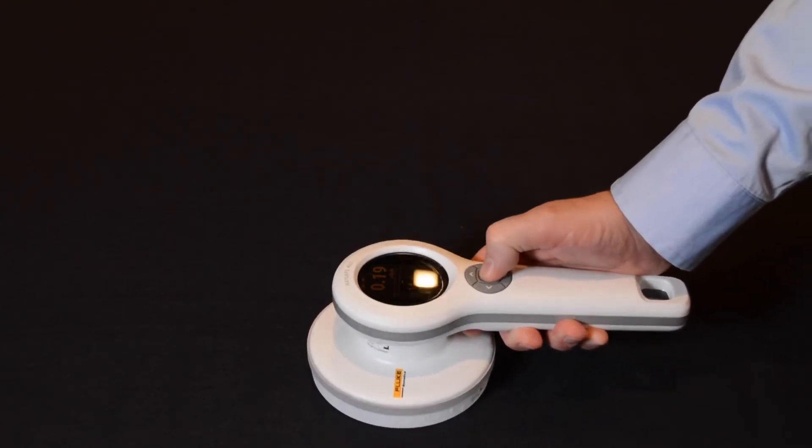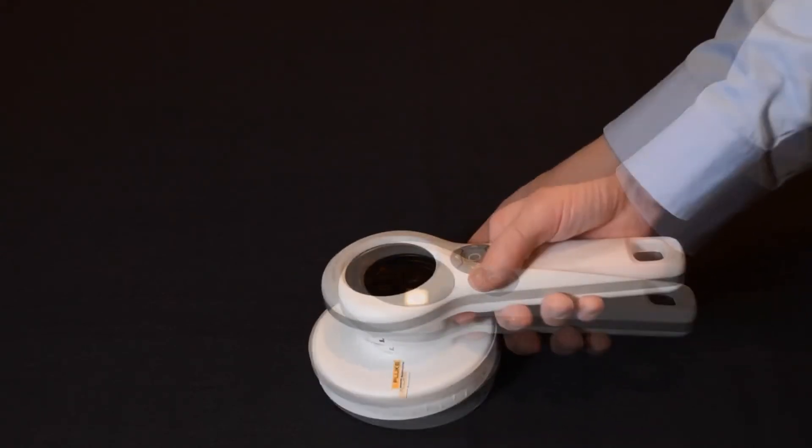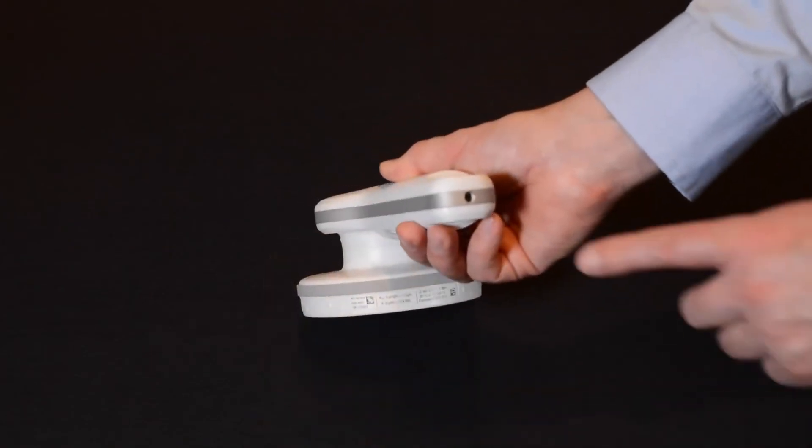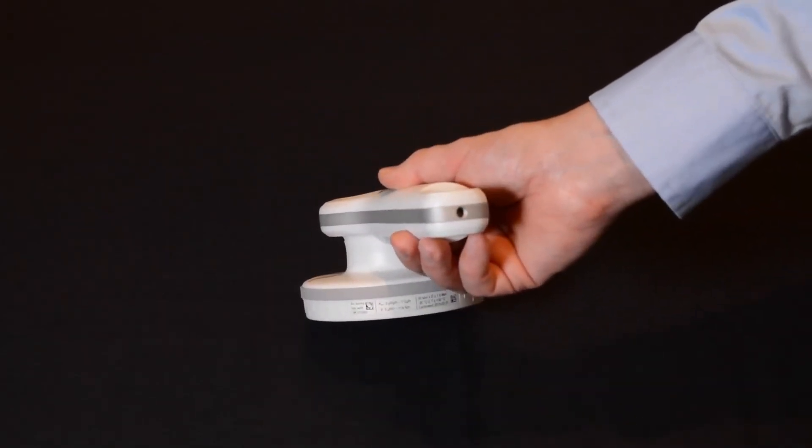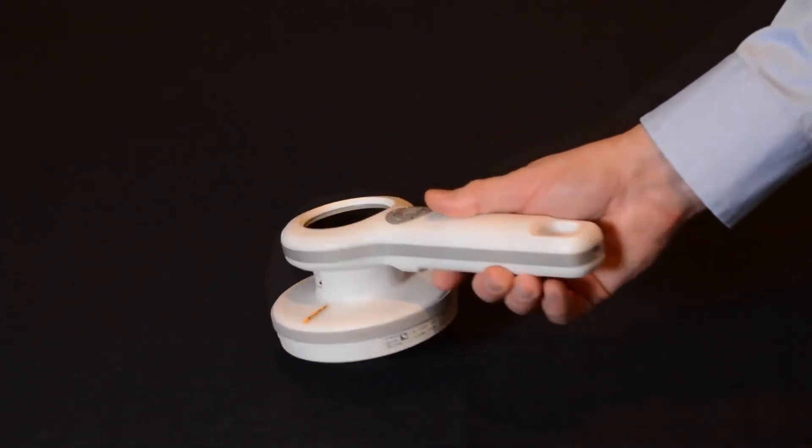The buttons are within easy reach of your thumb when holding the device. You can add a shoulder arm or wrist strap for easy carrying. There is a threading at the end of the device, so you can place the meter on a camera tripod.